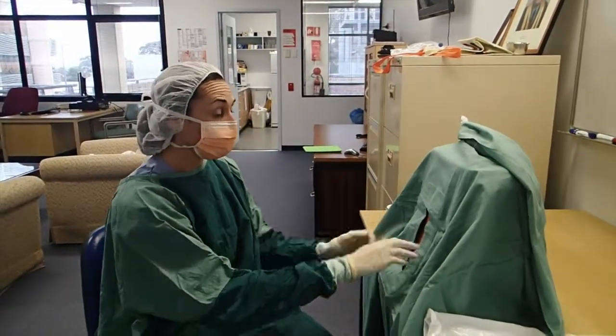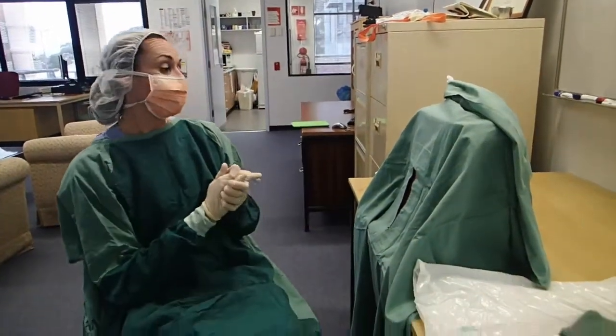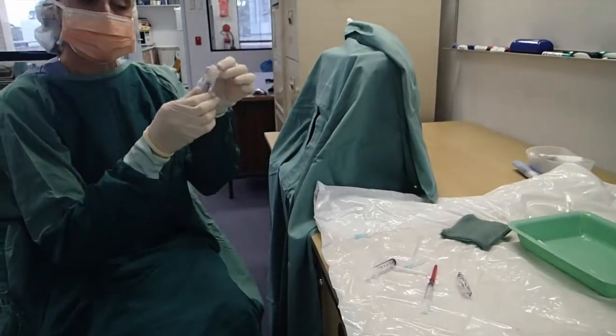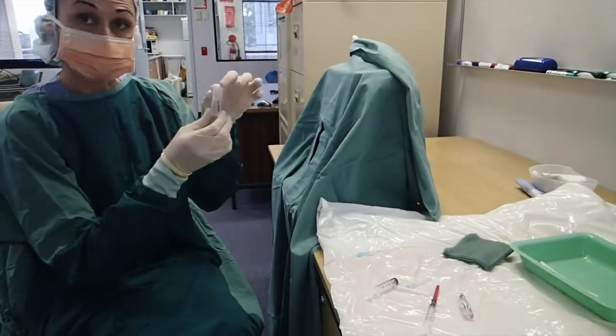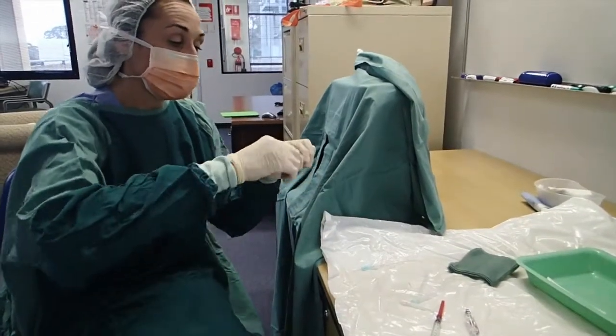Okay, so now we're going to perform a spinal. As you can see, I've prepped the skin and I've put a sterile drape on. Everything on this tray is sterile. So first I'm going to draw up my local anaesthetic to numb the skin, which is lignocaine 1% in this case. We'll draw that up in our syringe. All of this is sterile.